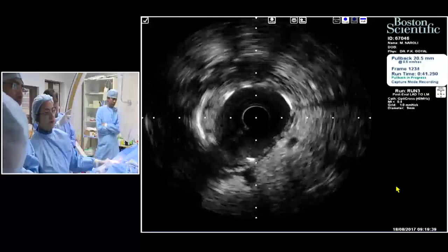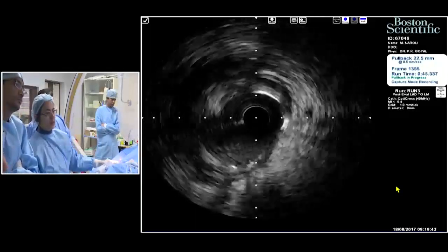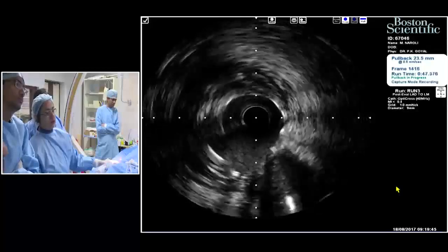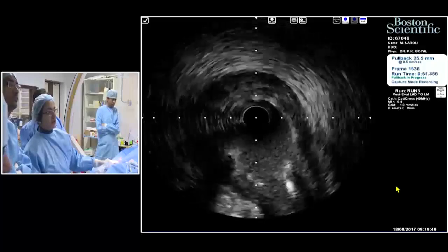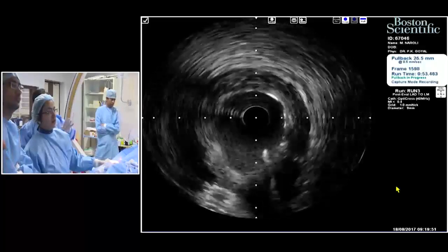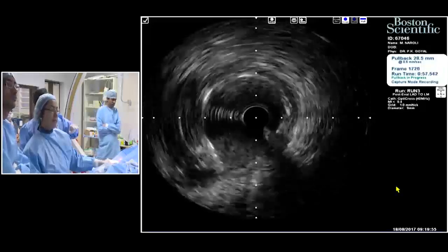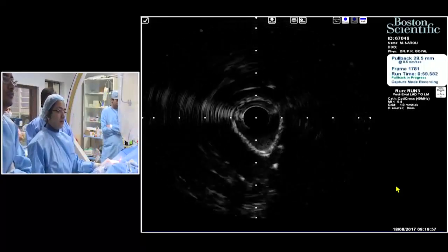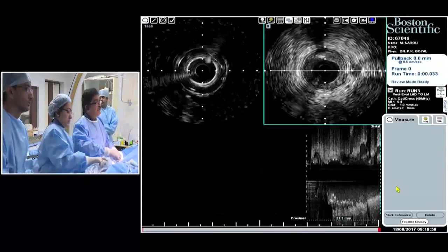It's a little under proximally. I think I'll do some more. 3.5 NC, I think. It's a little under proximally, even angiographically. So I'll do some NC here also. Then that's the circumflex that's come up. Now in the left main, I think I'll do some NC in the proximal part of LAD.